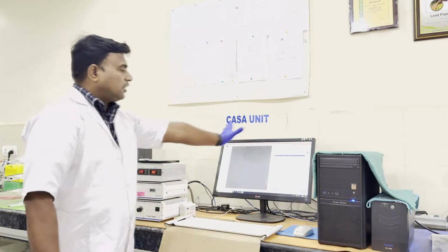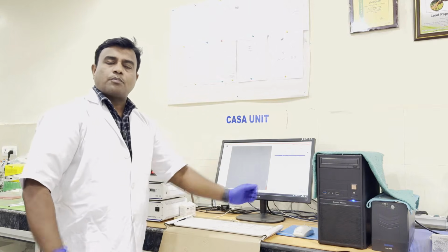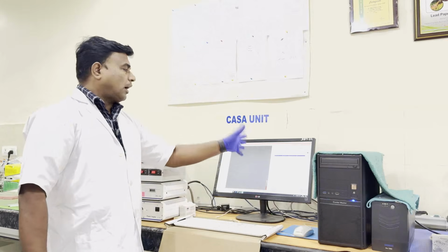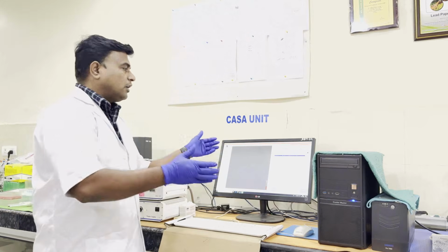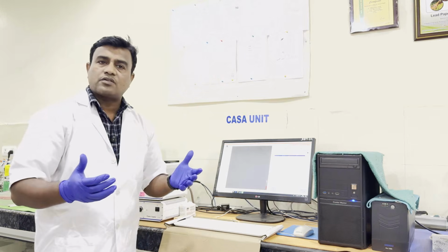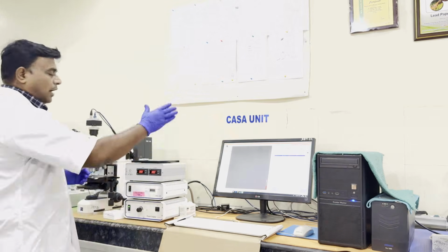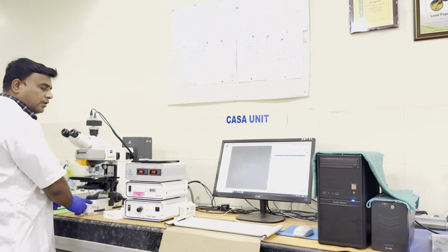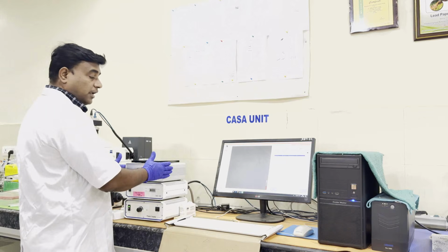But in this case, it will show an interface like this. Before recording anything in the interface, I will show in part 3 how the interface is used with a very close setup, so that you can see how the analysis is going on. Now, coming to after the interface, here is a power pack system which is providing the light, and here the heating plate is there.